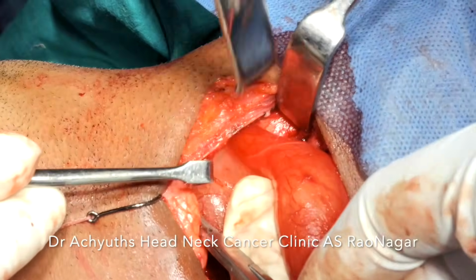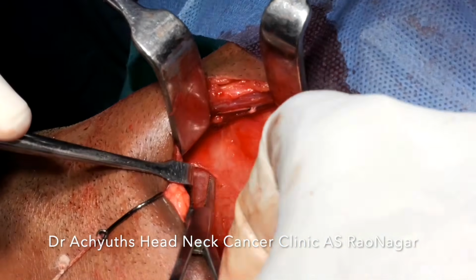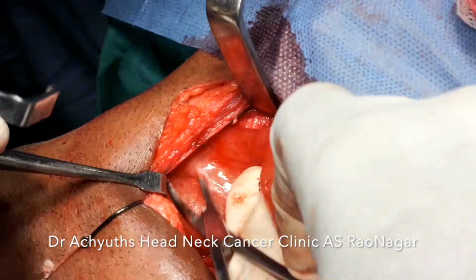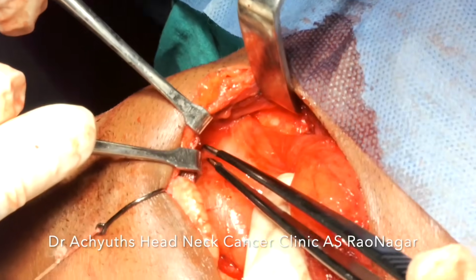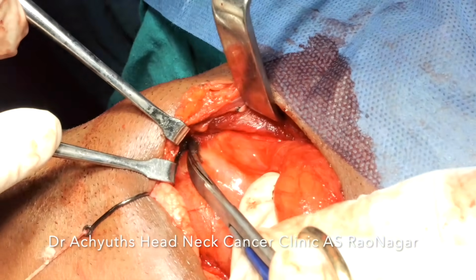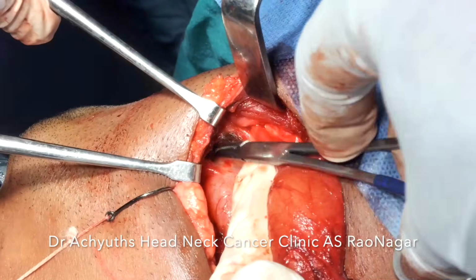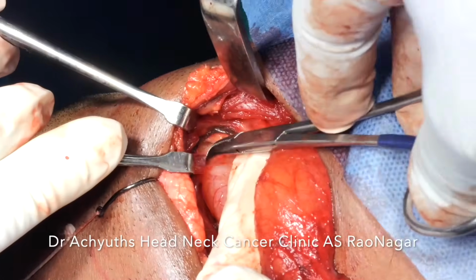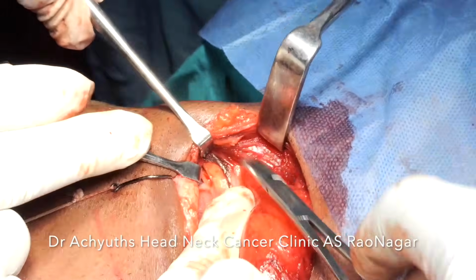As per the general description of the excision of the internal component, we can cut the thyroid cartilage like a V-shaped cut over the thyroid cartilage, excise the entire part, and then again use a Prolene stitch to reconstruct it. But then here I did not get any requirement of such kind of dissection of the thyroid cartilage.